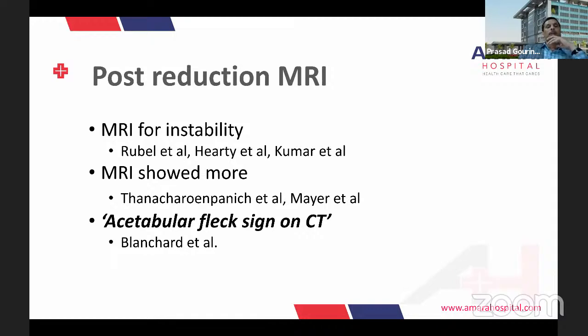So post-reduction MRI is strongly indicated if there is any instability on your exam. But again, instability is a relative thing. You can push hard enough any pediatric hip out. So I think routinely, post-reduction MRI is a good idea. We published a study showing that, the patient I showed you earlier and a couple more, with Hardy, my resident, and two other people. Also recommended that fractures are being missed on X-ray and CT. Two other papers said MRI shows a lot more, even when there's no instability and no incongruity, there can still be stuff in the joint that may not be visible on X-ray and CT scan. So it's a good idea to get an MRI post-reduction. The fleck sign I told you already: in a CT scan, a small little fleck of bone can be a large fragment.